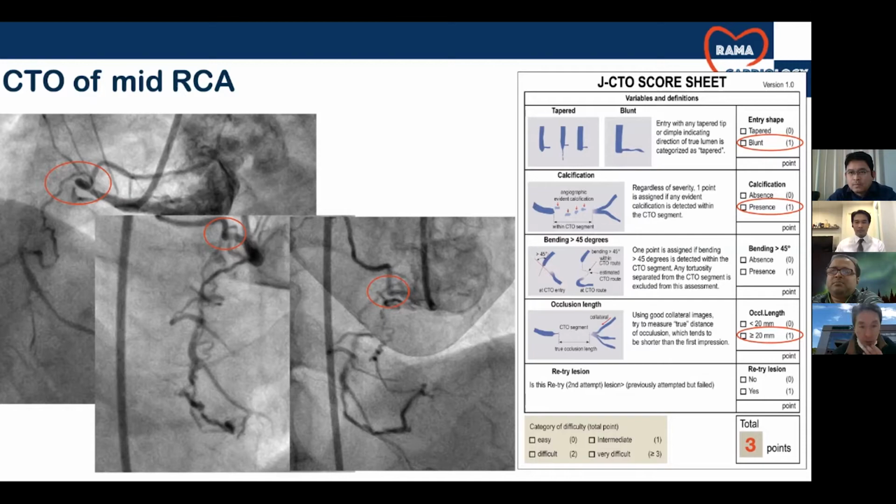Yeah, congratulations on this procedure, because this patient is a very difficult case. I have a question about dual antiplatelet therapy, because the circumflex stent is not so bad, but completely occluded. How was the patient? Yeah, he confirmed he took DAPT all the time, no discontinuation by himself. Yeah. And also this is well collateralized, and the RCA shoulder part is a 90 degree bend, so it's very difficult if you don't get ready with the retrograde approach. I think it's a good way.